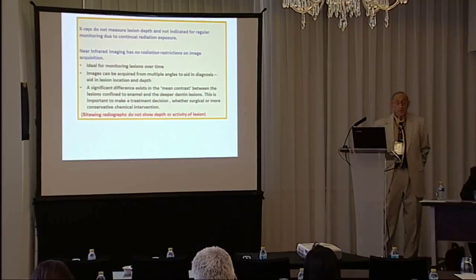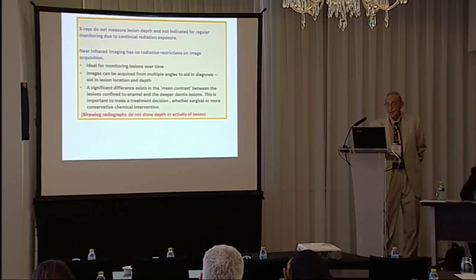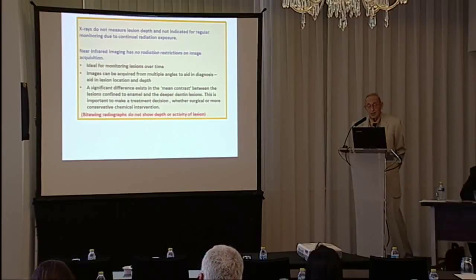A significant difference exists in the mean contrast between the lesions confined to enamel and the deeper dentin lesions. This is important to make a treatment decision, whether surgical or more conservative chemical intervention. Bitewing radiographs do not show the depth or activity of the lesion.